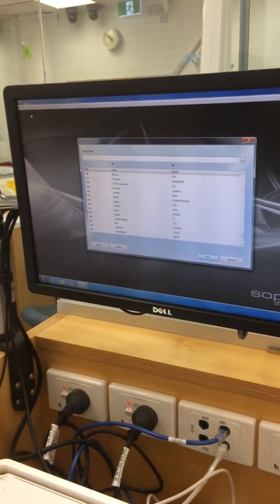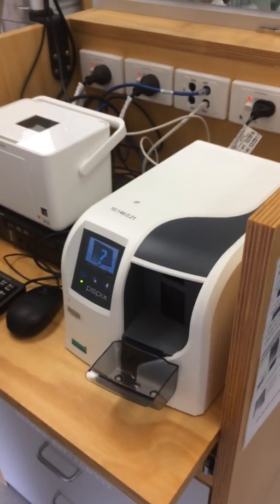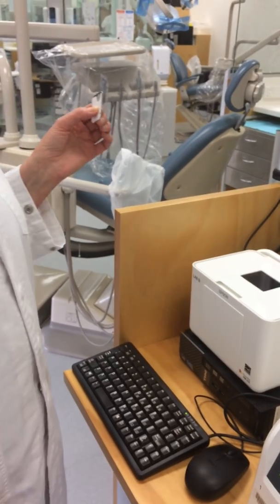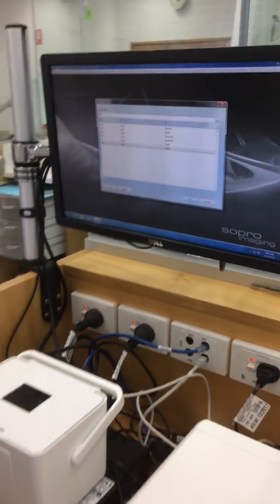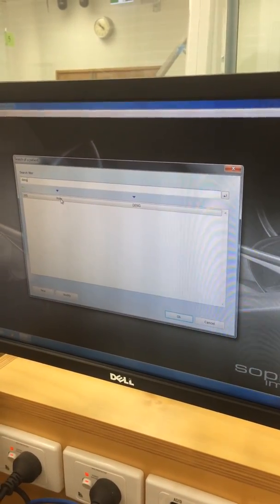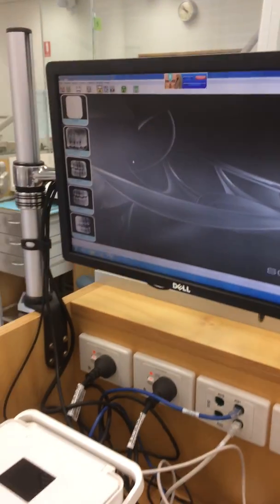Now we're going to demonstrate how to process an exposed phosphor plate. You need to hold your phosphor plate in your non-dominant hand, and you need to search for your name — you just pop in usually your first three letters of your surname, and bring it up.